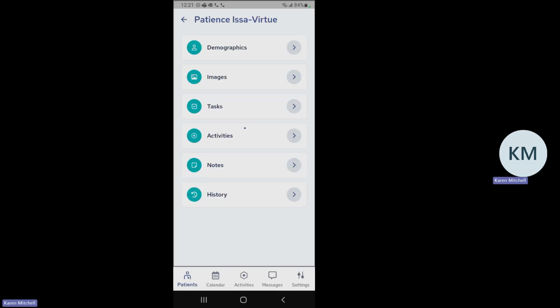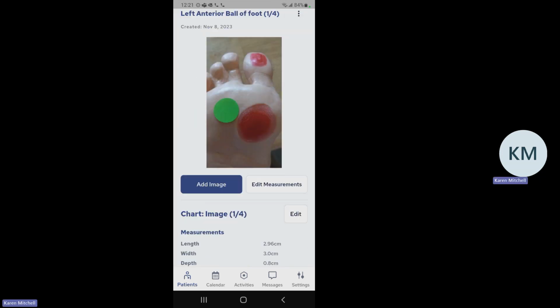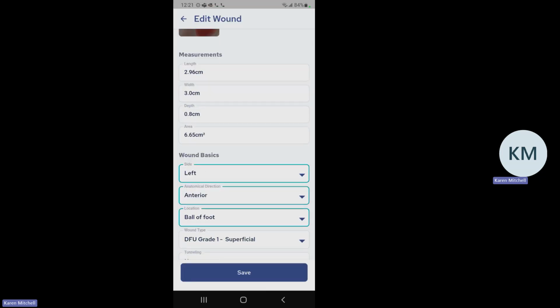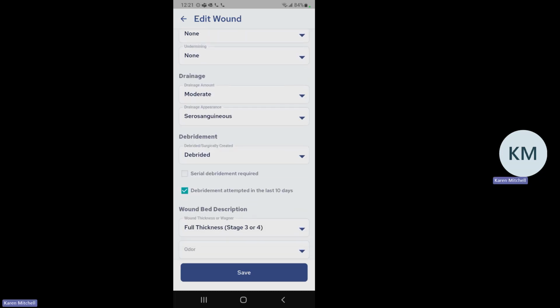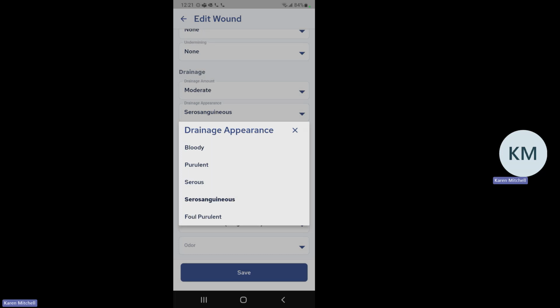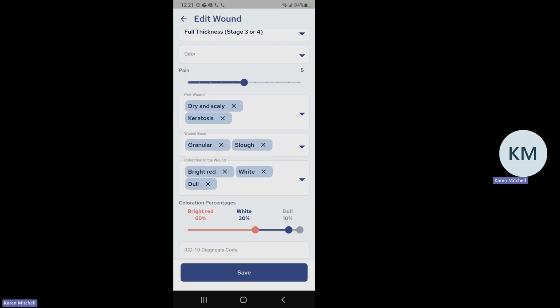One of the things we do very well is our wound documentation. It affirms best practices, is informed by CMS, makes it easy to be compliant, and increases confidence in the process. Our look and feel guides the user through simple forms to create compliant wound documentation.